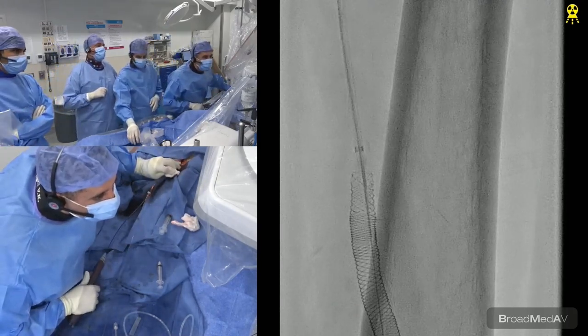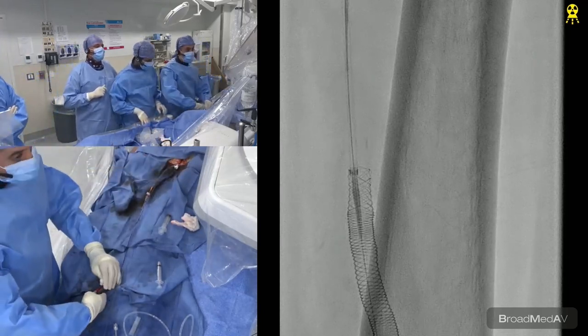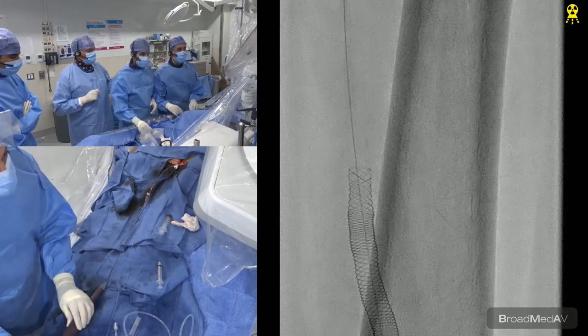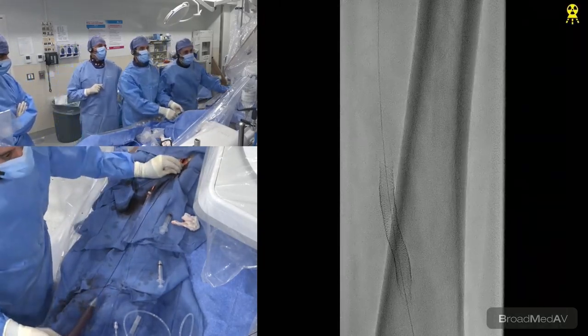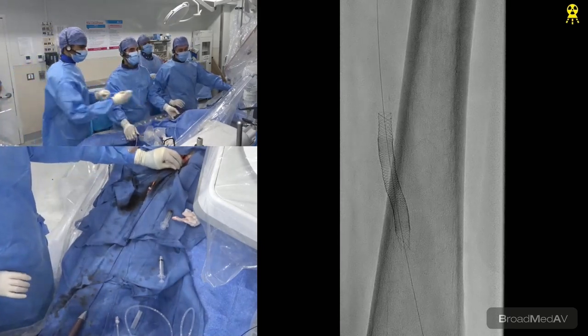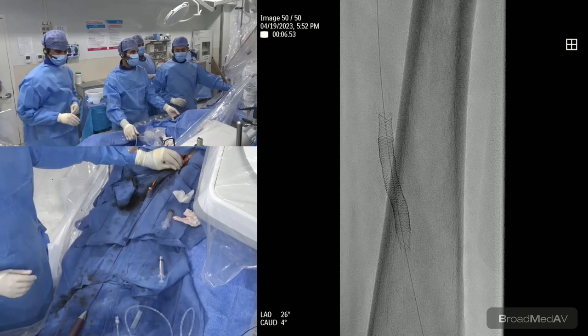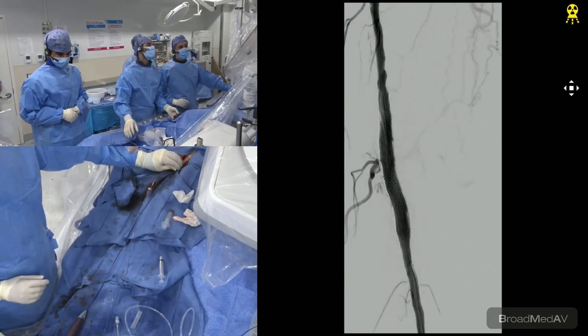Adjusting the length of the Supera after deployment is still possible. I think it's also important for everyone to know that there are a few tricks that you can use to make the Supera be closer to its nominal length. Usually, I feel that we may or may not end up doing something like that here. Yeah, let's do a quick pressure wire, guys. Take a picture.